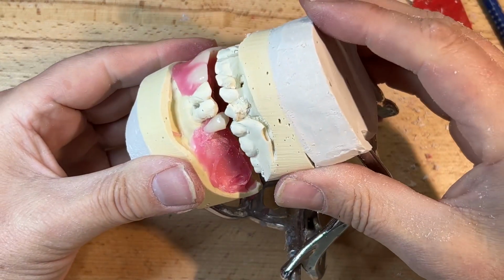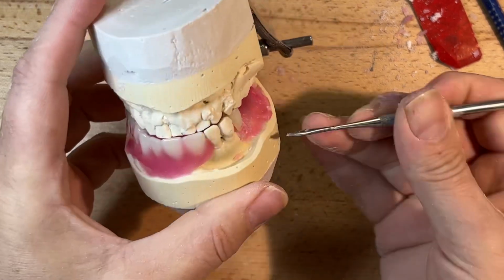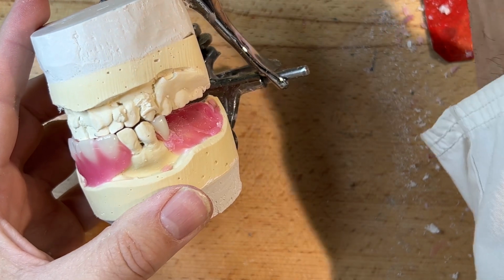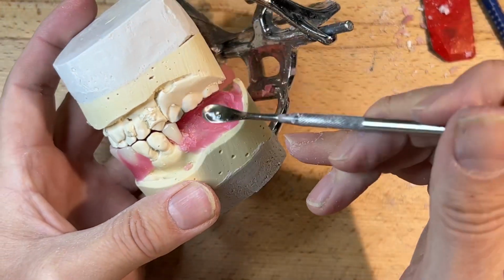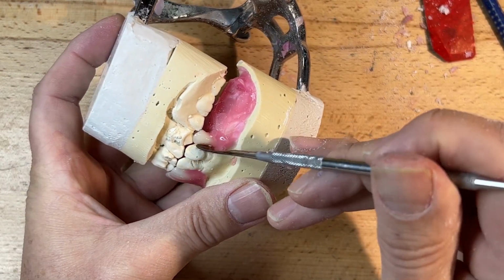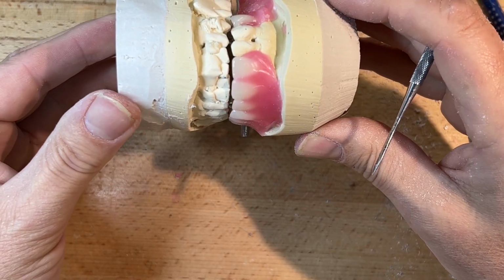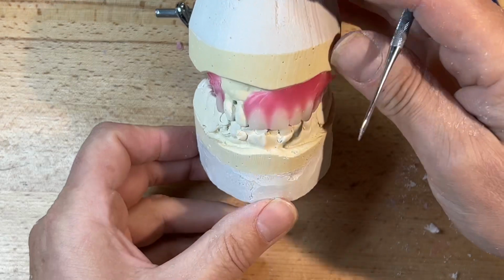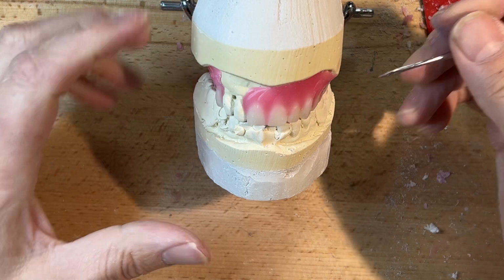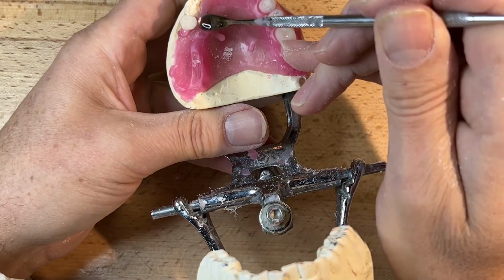Get some wax out of the way. Again, emergence angle, do not have this more buccal inclination. Or excuse me, don't have this more buccally in a bodily position outside the line angle for the buccal corridor. This whole line angle corridor is maintained. I think it's a pretty decent transition from 3 to 4, matching the other 3 to 4. Bit of wax.